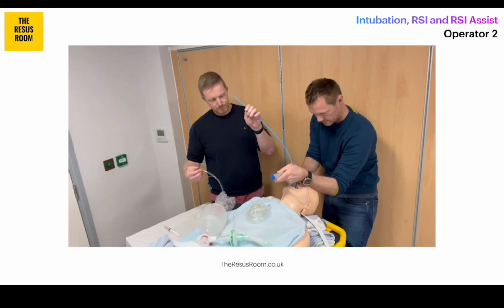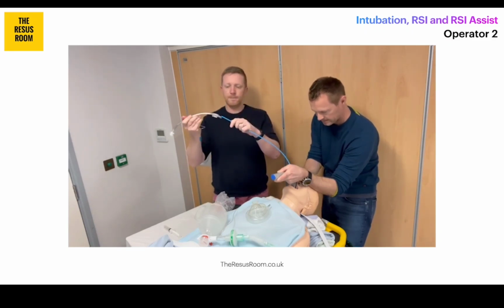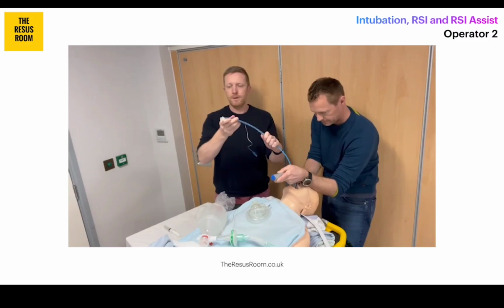Cool, now you can see Simon just gently supporting the end of the bougie. He's not manipulating it, he's not moving it, but he's just supporting it. And that prevents it from whipping around and taking my eye out if I get a bit carried away. But it also means that he is ready to slide the tube over when I give him the nod.